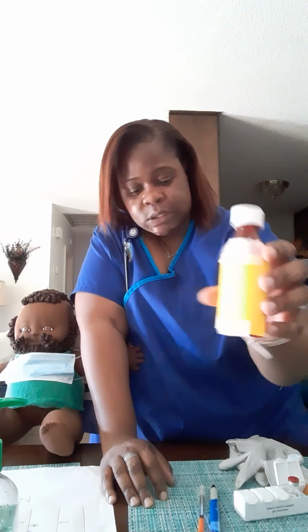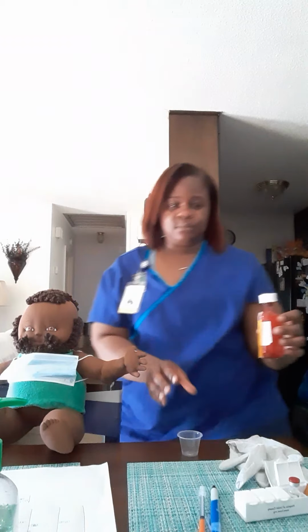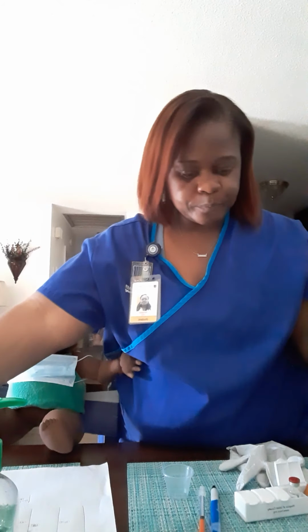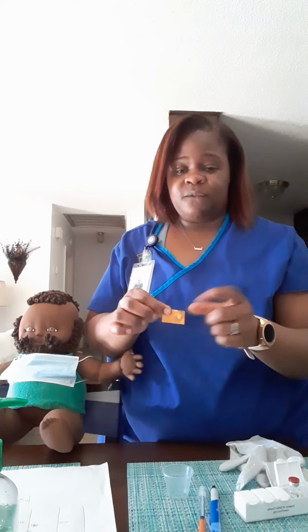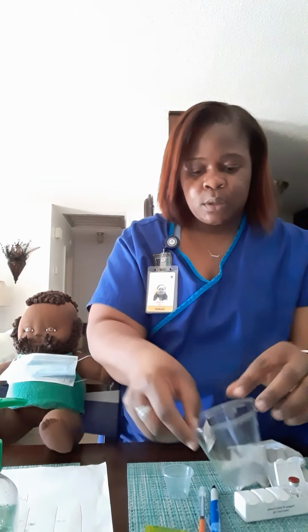I'm going to next do my calculations. So for the Dilantin, with it being 125 in a 5 ml suspension, the patient would get 15 mLs, and I would put this at eye level, and I would pour 15 mLs into my medicine cup. My Coumadin comes in a 5 milligram tablet. I'm going to check the expiration date. I'm going to take this Coumadin and cut it in half.